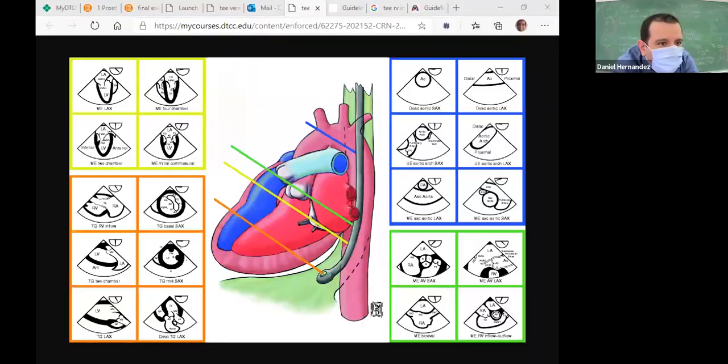So if I go to our views and you see the little angle marker here, when I search this one, it says 90 degrees. So that's 90 degrees, this is 0 degrees. I was looking at hers. It's a little past 90. So 180 would be on this side.